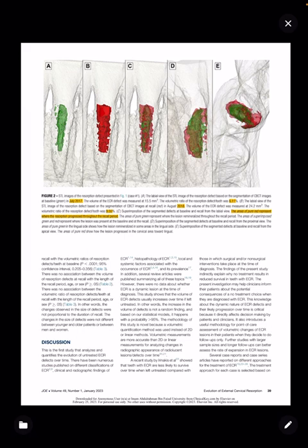And in figure 2, these are still images of a case segmented from the patient's CBCT. A, the labial surface of an affected tooth at baseline with the defect in green, while C is the overlapped STL at 1 year recall, with red highlighting the resorption defect extensions.